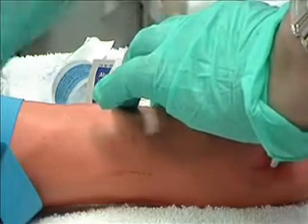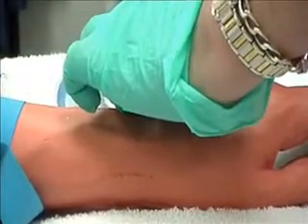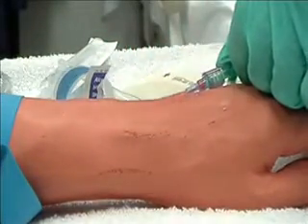Quickly connect end of infusion tubing set to the end of the cannula. Do not touch point of entry of adapter. Begin infusion by slowly opening the clamp of the IV tubing.